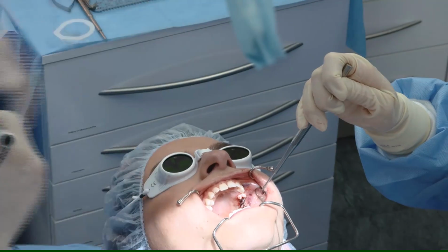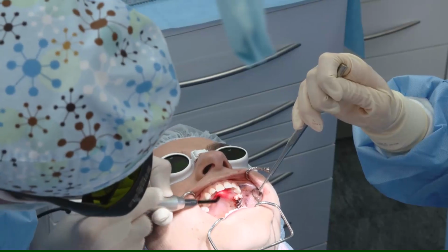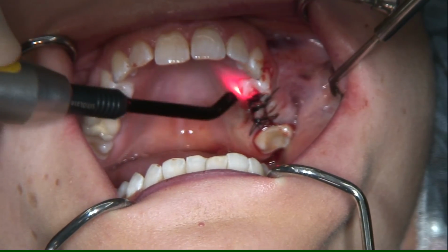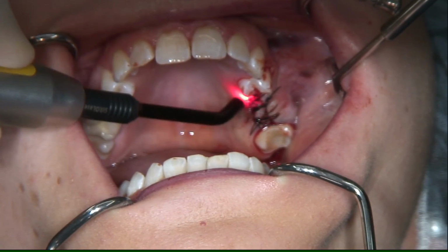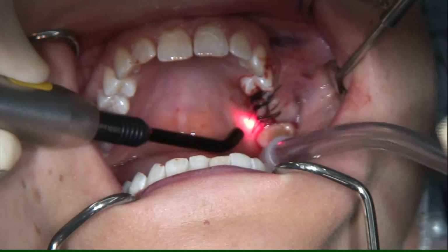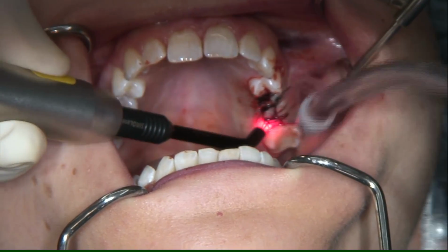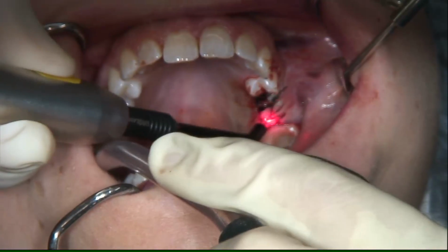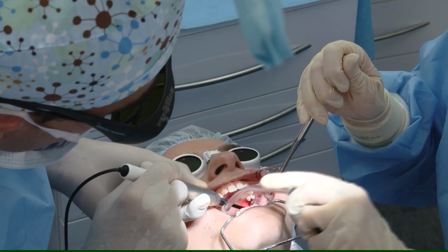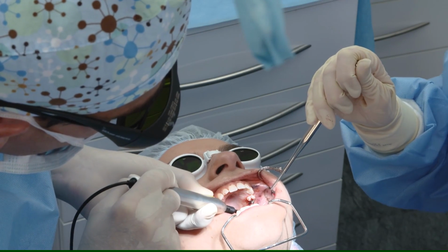What you're using here is the soft laser treatment with the 660 nanometer and less power than the blue diode, so here only 25 milliwatt, to get improved bacterial reduction, less post-operative pain and scar-free wound healing.